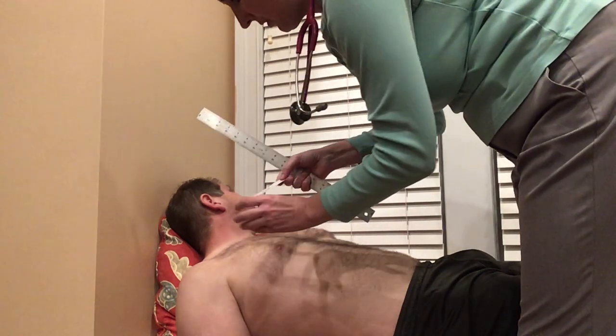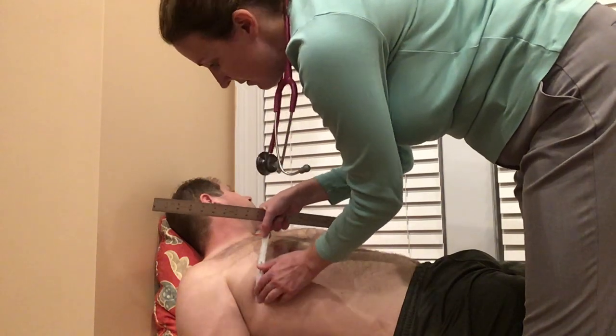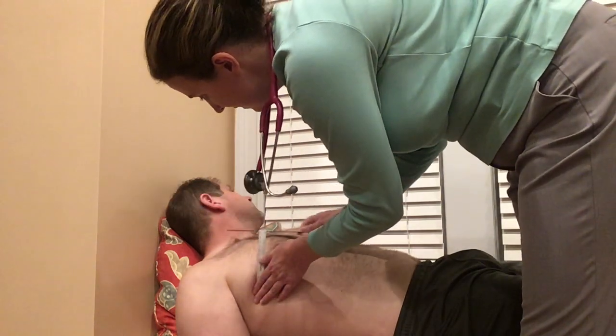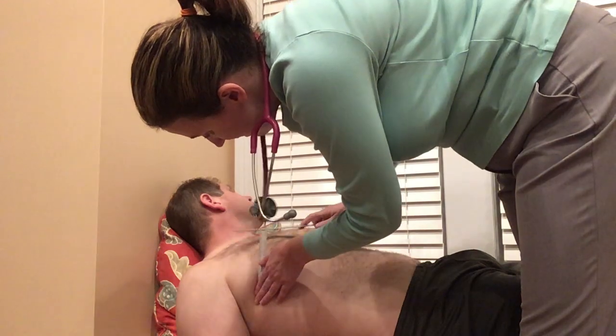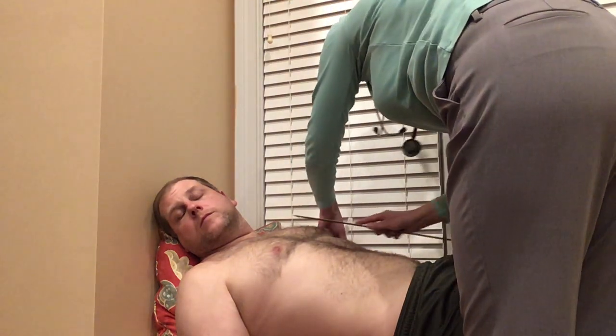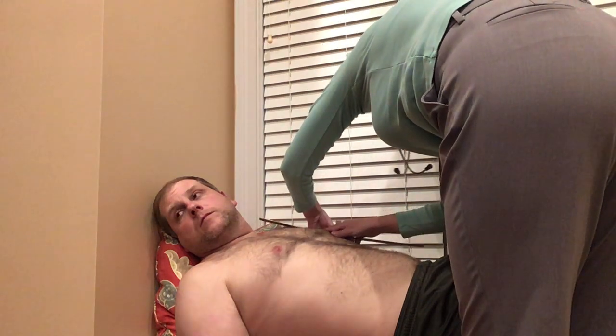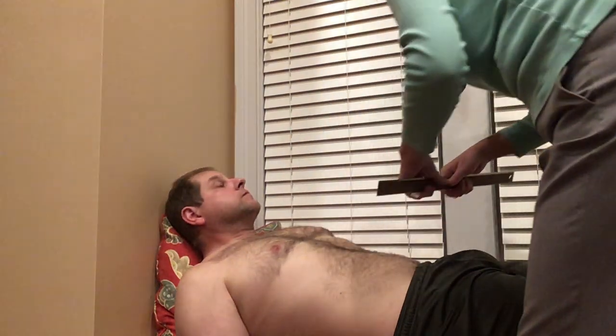Mark is very muscular. Place this at mid-axillary line level of the nipple. And that puts us right about 9 centimeters. We'll do the same on this side. Please look to the right. And again at 9 centimeters.